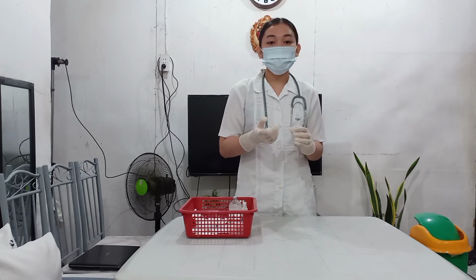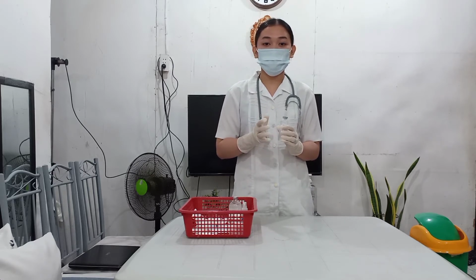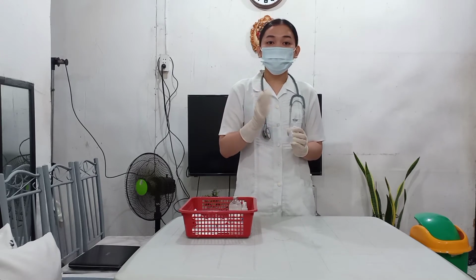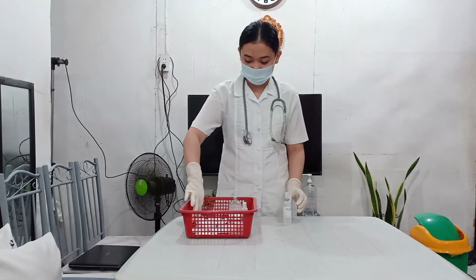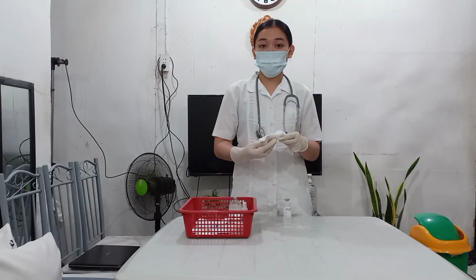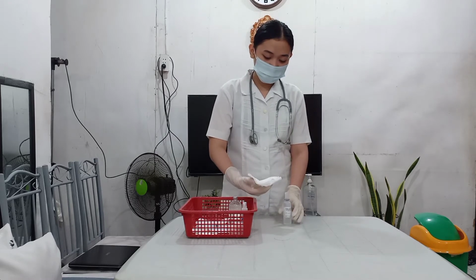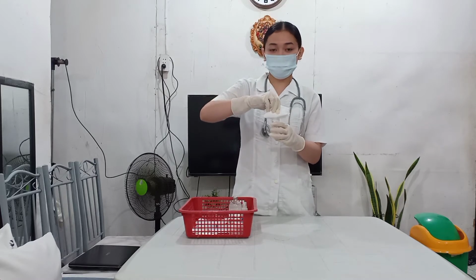Next is to place a piece of sterile gauze between my thumb and the ampule neck. This is to prevent getting cuts from any shattered glass fragments, especially if you are using a glass ampule. Since I don't have a sterile gauze, I have prepared here a paper towel, assuming that this is a sterile gauze. So, I am going to place my sterile gauze here in the neck of the ampule.